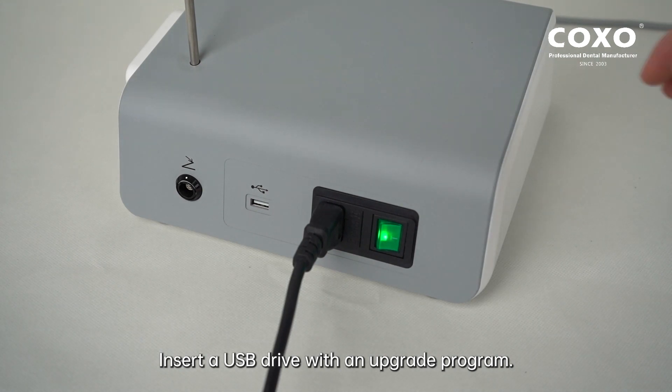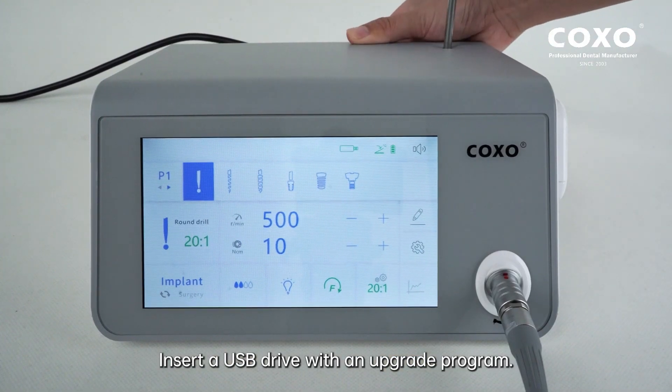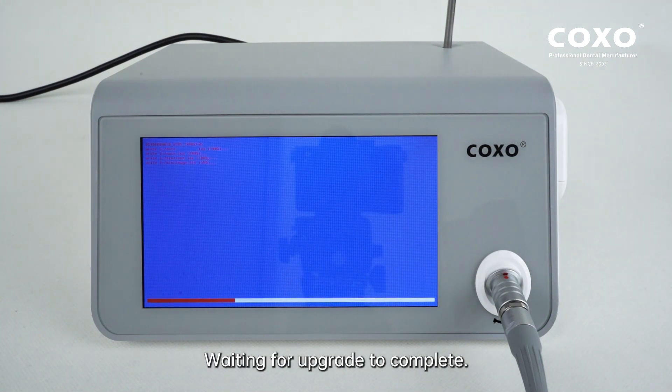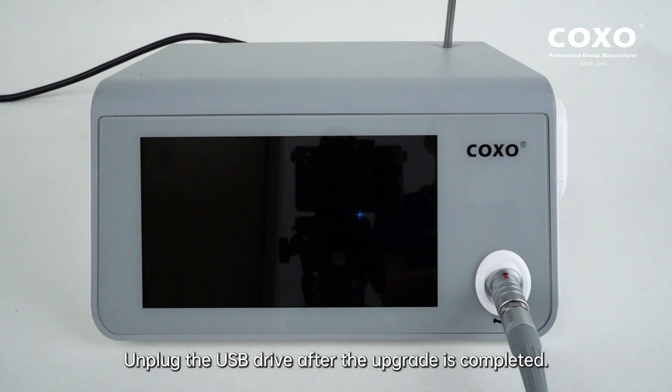Insert a USB drive with an upgrade program. Wait for the upgrade to complete. Unplug the USB drive after the upgrade is completed.